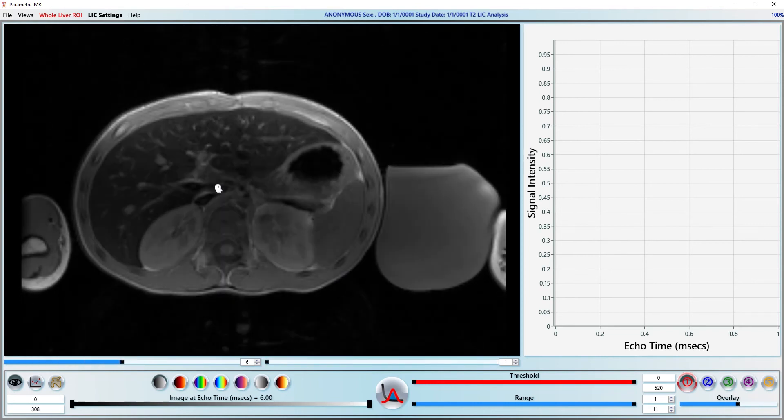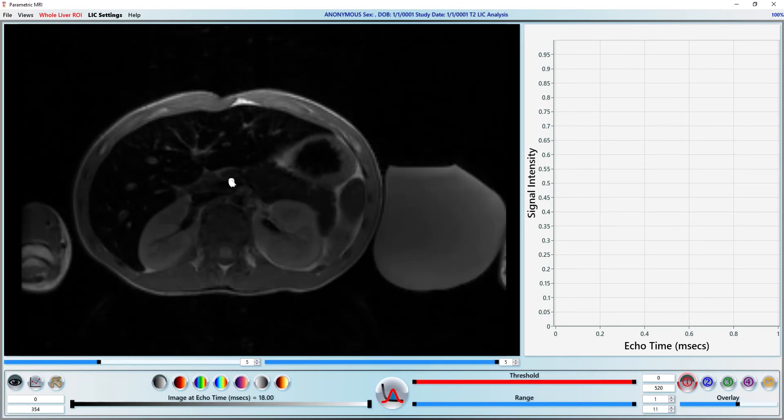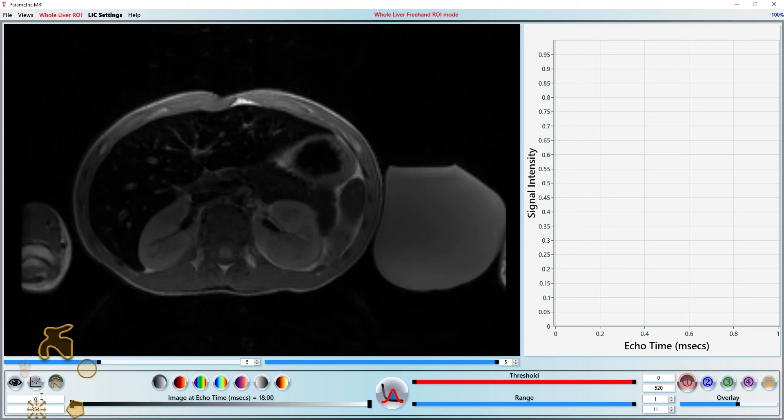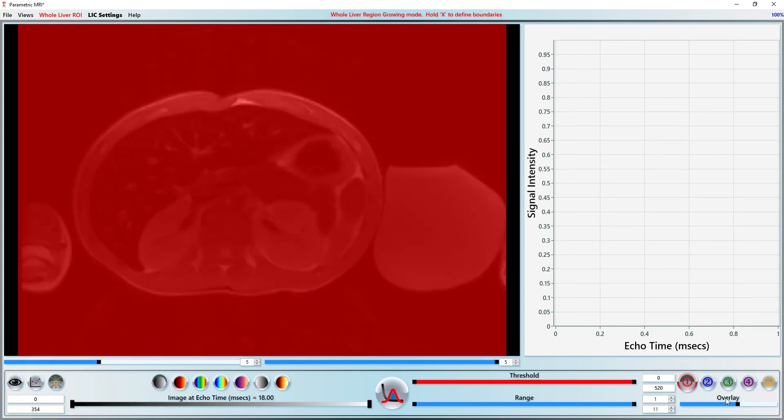The steps to analyze the data are the same as before. Let's define our ROIs. For R2 data, I prefer to region grow and threshold the raw data instead of an R2 map like we did with the previous dataset because of the breathing motion artifacts.